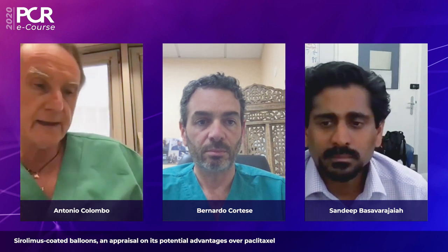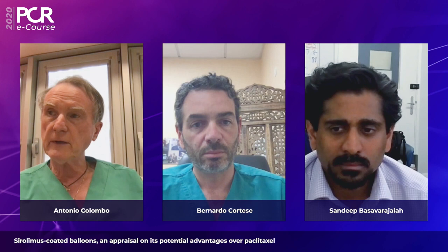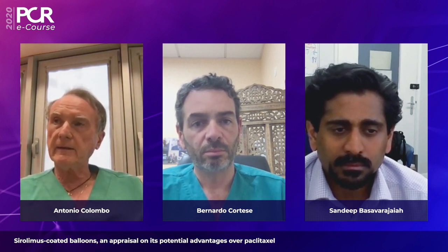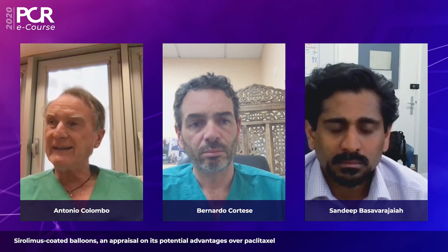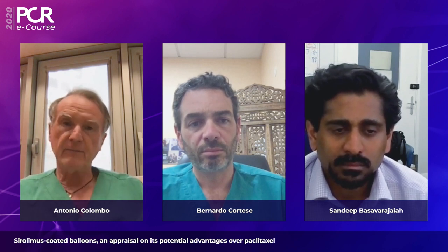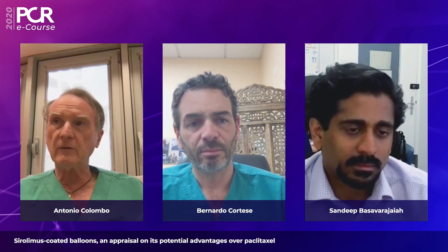Bernardo, I totally agree with you that the delivery of this balloon is very easy. It comes in between a semi-compliant balloon and the best DES. On a scale of 1 to 10, if you give 10 to the semi-compliant balloon, I will give this balloon 8 for deliverability, and the best drug-eluting stent I will give 7. So it is superior to the best drug-eluting stent and slightly inferior to the best semi-compliant balloon.